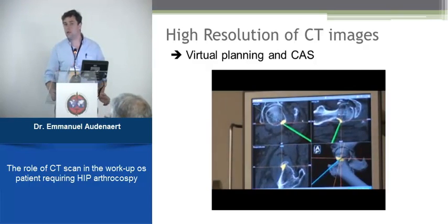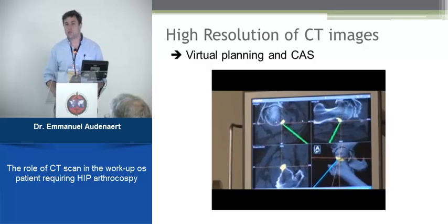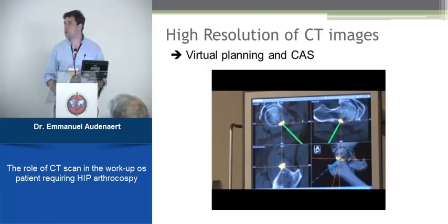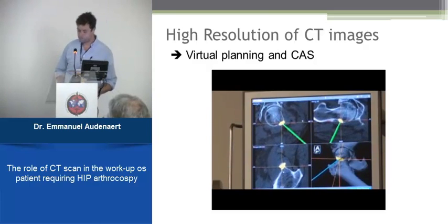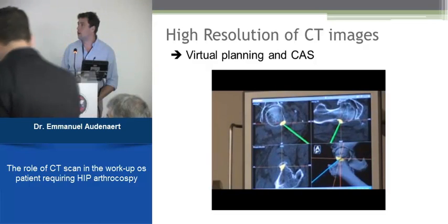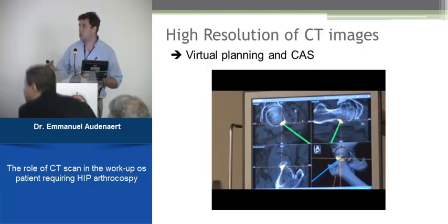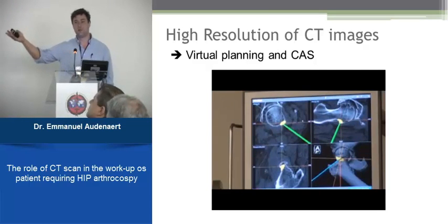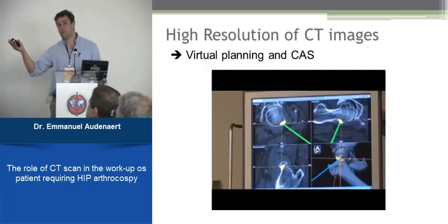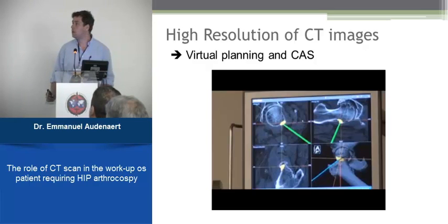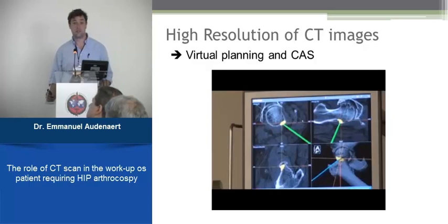In conclusion, CT imaging data offers a huge amount of information. Like any regular navigated surgery, you have to register your tools and calibrate, and this is the extra view that you get on top of your regular scope view. You see what you're doing on the lesion with your burr, and for me, this is a huge advancement.